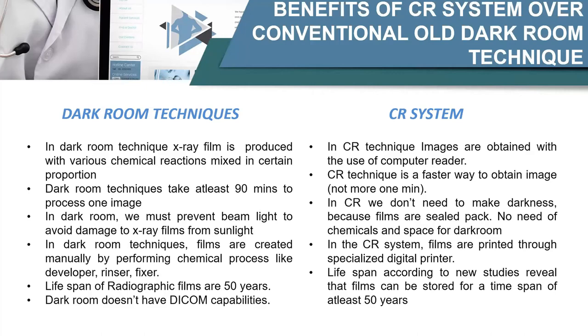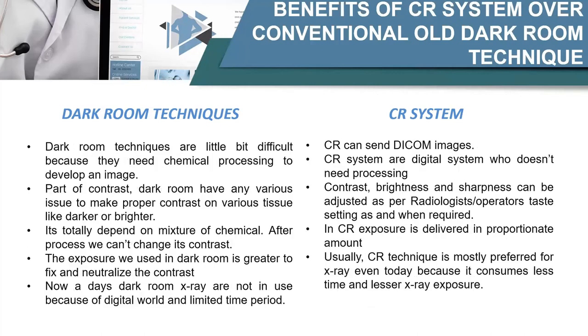Next slide, please. In the darkroom technique, it is a bit difficult for technicians to develop an image because there is chemical processing. The chemicals are harmful actually for the skin or for the respiratory system. Here we don't use any chemicals in CR system, so it is quite comfortable to use.